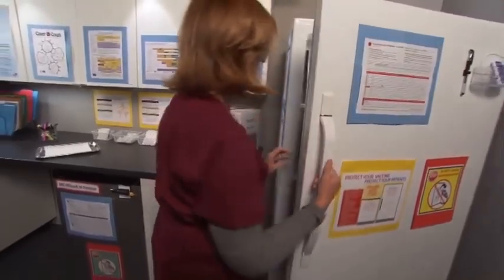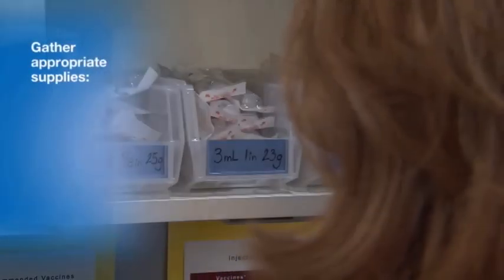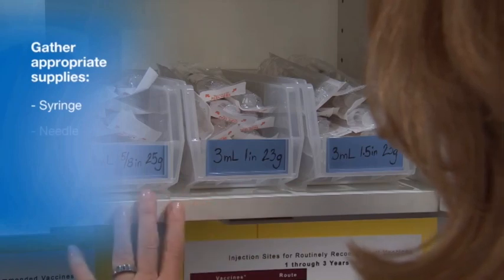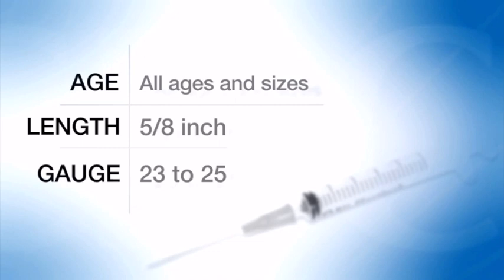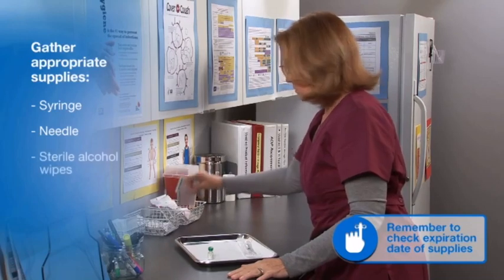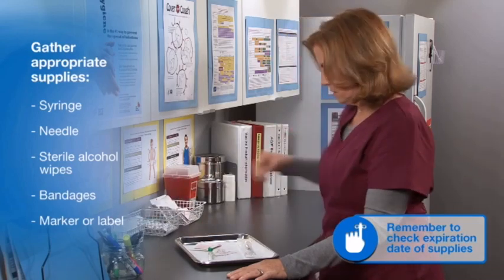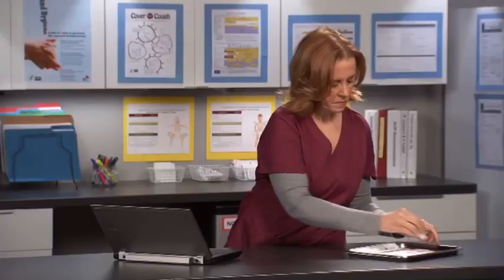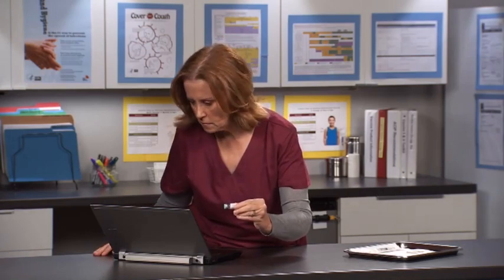Begin by removing the vaccine from the storage unit. Next, gather the appropriate supplies. This includes a syringe and needle. Use a 23-25 gauge, 5/8 inch needle for subcutaneous injections, regardless of the age or the size of the patient. Also gather prepackaged sterile alcohol wipes and bandages. Needles and syringes may be packaged together or separately. Verify the vaccine you are preparing matches the standing order or the provider's order.